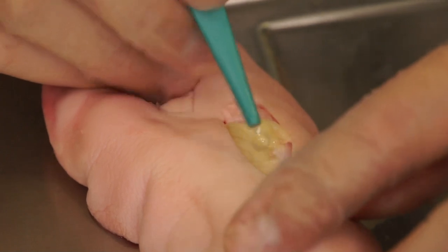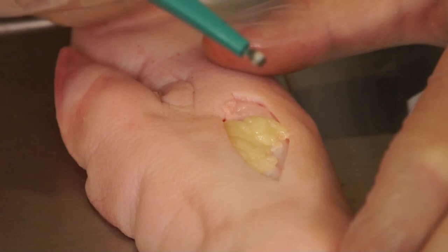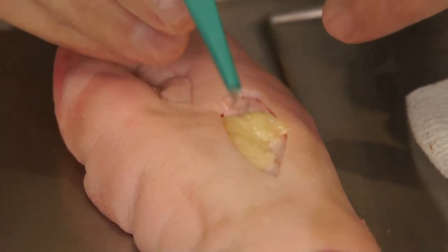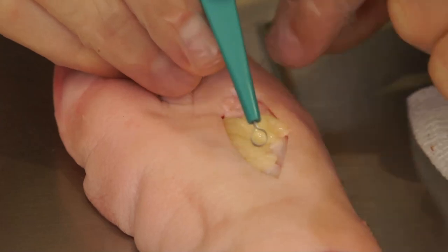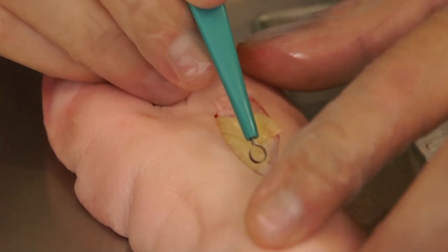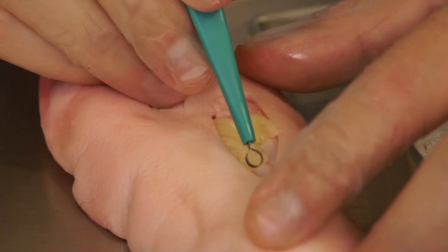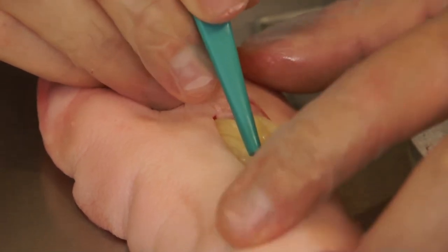A dermal curette has cutting edges on both sides of a circular blade. It is commonly held in a pen-like fashion and is applied at a 45 degree angle to the wound bed. It is important to maintain the curette parallel to the surface of the wound, as turning it on edge will create a knife-like application.